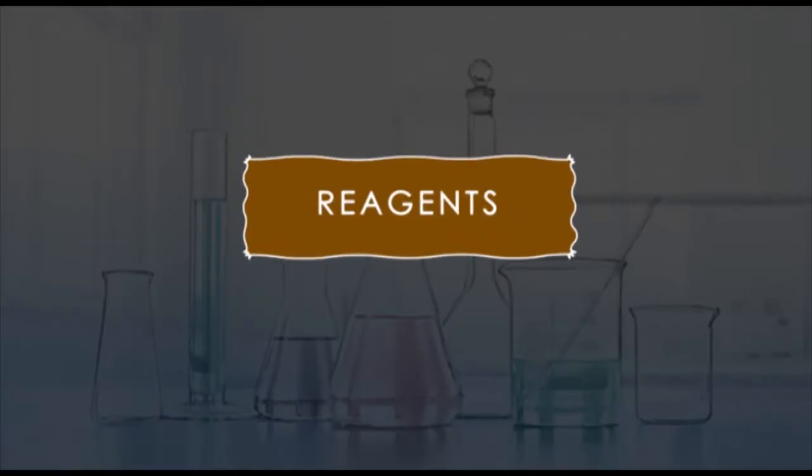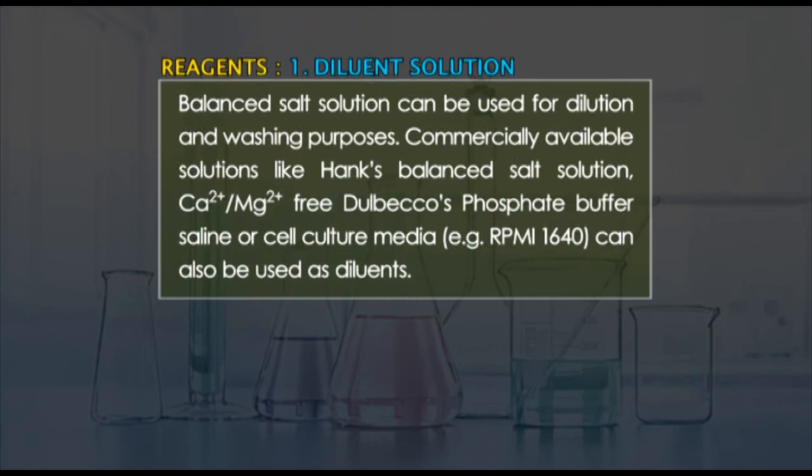Reagents. Diluent solution. Balanced salt solution can be used for dilution and washing purposes. Commercially available solutions like Hank's balanced salt solution, calcium magnesium free Dulbecco's phosphate buffered saline, or cell culture media, for example RPMI 1640, can also be used as diluents.